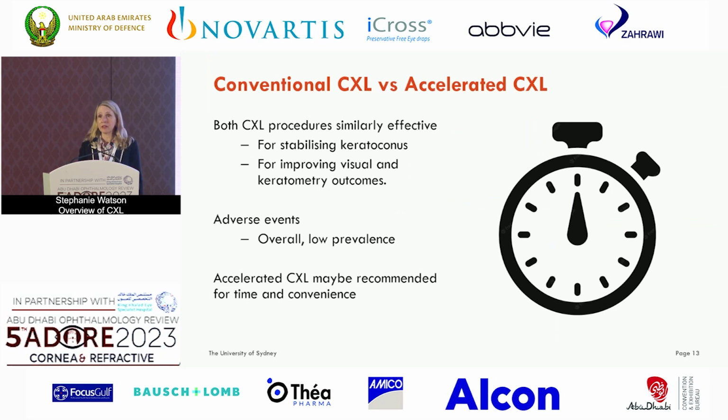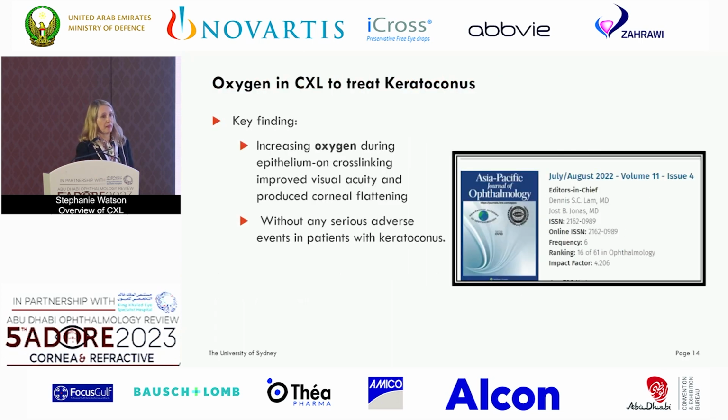Now, when we looked at conventional versus accelerated cross-linking, we found that both treatments were about as effective in stabilising vision, in stabilising keratoconus, and for both, the adverse events were low and similar. So, in general, accelerated cross-linking may be considered because it creates greater patient comfort and convenience for the surgeon.